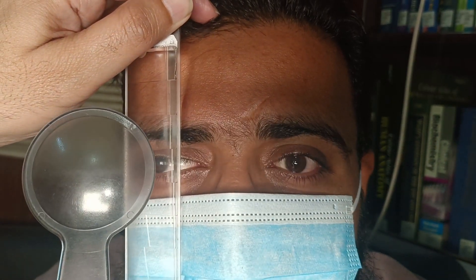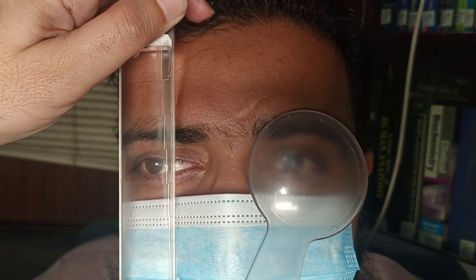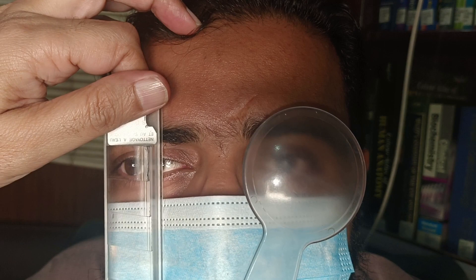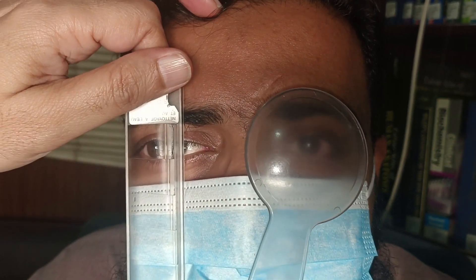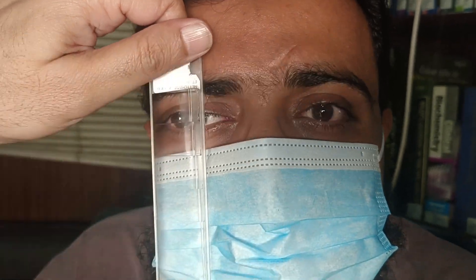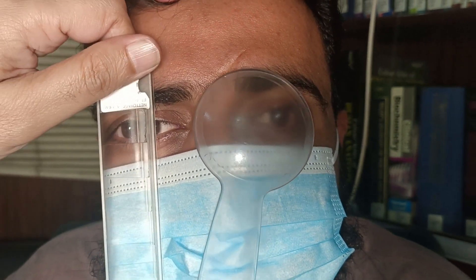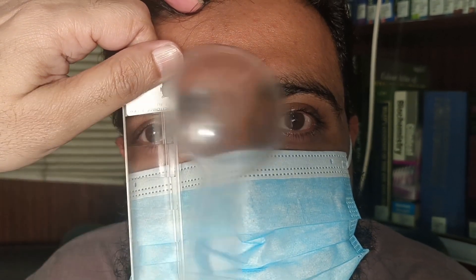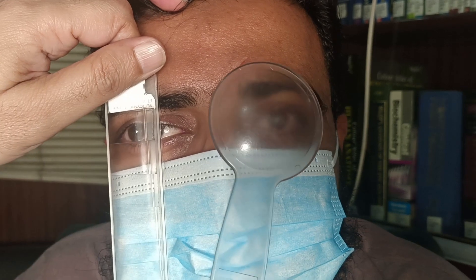The squint still remains stable. We want to take it to a point of reversal, where instead of exotropia it turns into an esotropia. Now you can see it's turning into a slight esotropia — instead of the eye moving from out to inward, it is going from in to out. This is the goal. The maximum is 45 prism diopters, and it tends to hold at this level. Now let's do it for near.